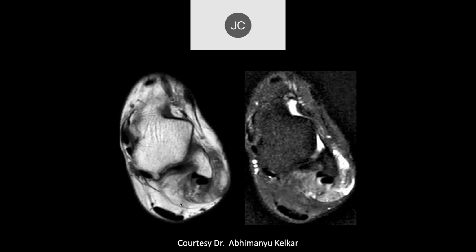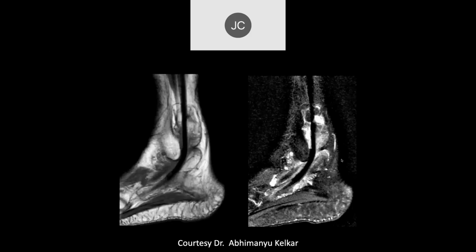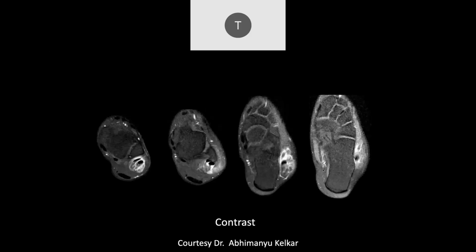I'm sorry. So here we're down now by the lateral malleolus. Yeah, a lot of fluid and synovial thickening. Yeah, a lot of synovial thickening here. So this really looks like there's a rip-roaring synovitis here, probably chronic. What do you think of the sagittal images? Yeah, a lot of synovial distension, thickening. Okay, and if you give contrast and scan farther down, this is what it looks like.